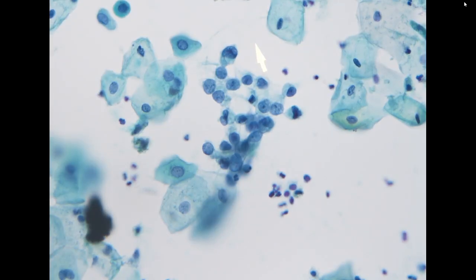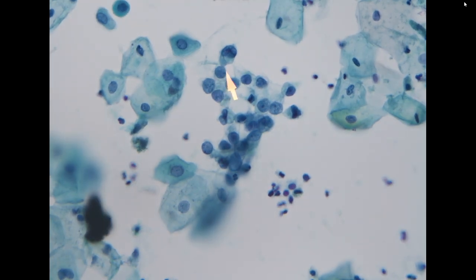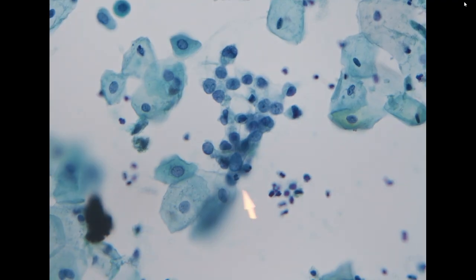That's increased NC ratio. The hyperchromasia in this preparation is not very prominent. The coarse chromatin is not very prominent. So I guess the previous preparation could be true, but it could also be artifact from the cytospin. So in this specimen, I think it is reasonable that we call it suspicious.